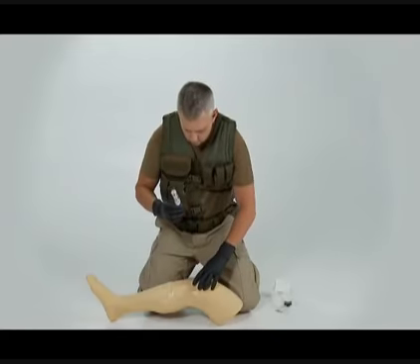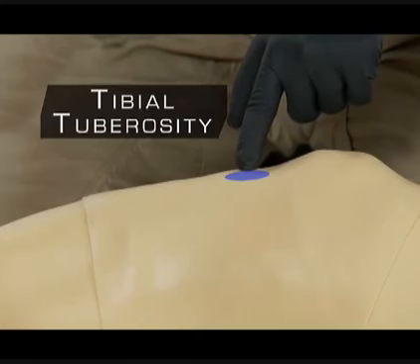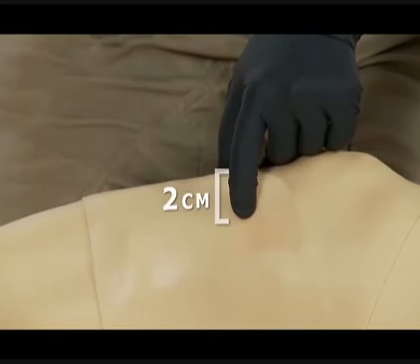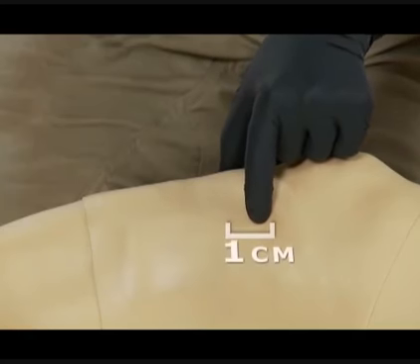To locate the tibial tuberosity, palpate down from the patella, or kneecap, toward the foot until you feel a rounded protrusion. This rounded protrusion is called the tibial tuberosity. For adult placement, begin at the tibial tuberosity and go approximately 2 centimeters medially or toward the inner part of the leg to find the flat portion of bone. This is called the tibial plateau. From the tibial plateau, go up approximately 1 centimeter or 1/2 inch proximally toward the patella.